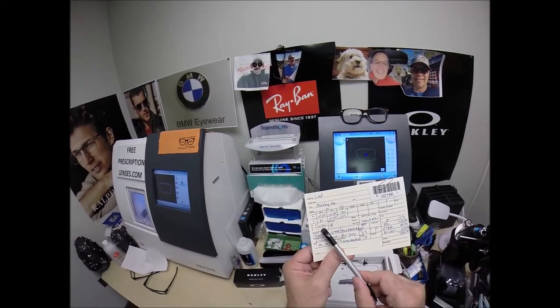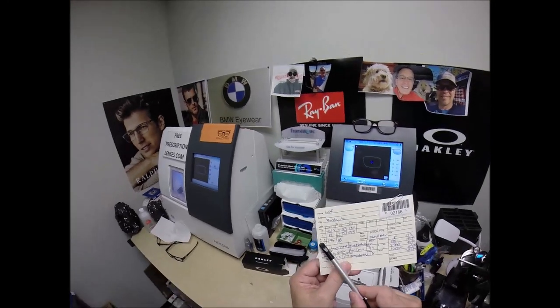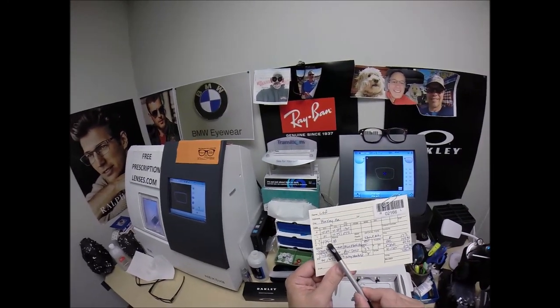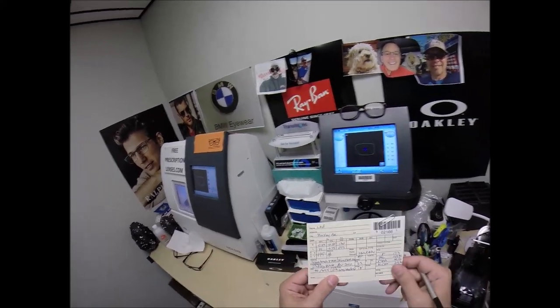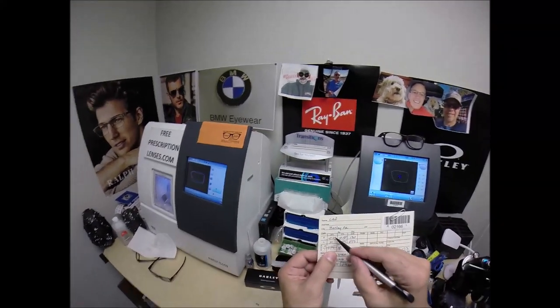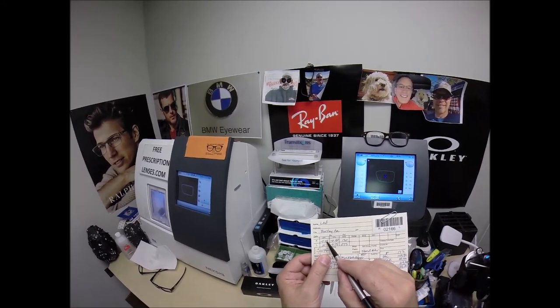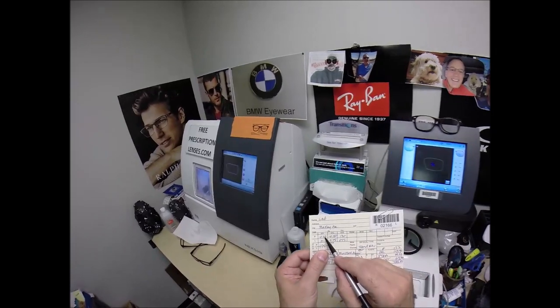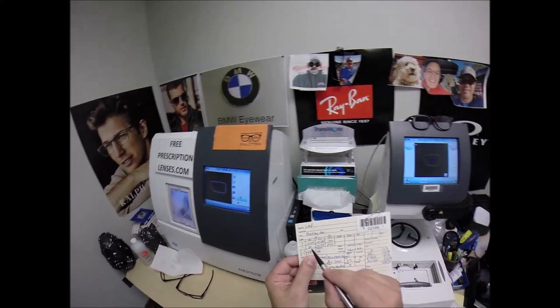Now, you have an Essilor Ideal Advanced Digital Freeform Progressive Lens. It's called the add, the bifocal strength, because it means in addition to what's up top. Now, for reading glasses, the over-the-counter reading glasses, you add these two numbers together. So technically, plus 175 and minus a quarter, you would need a plus 150 in your right eye. Plano, which is no power, plus 175 in the left.